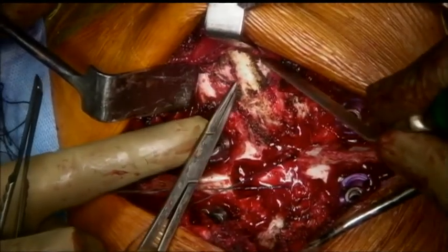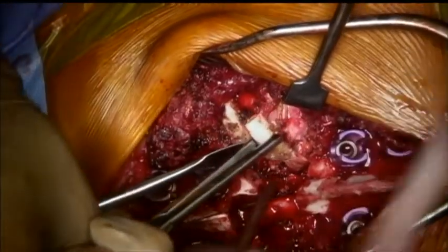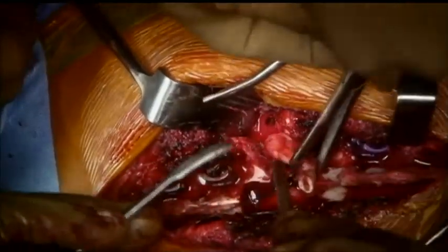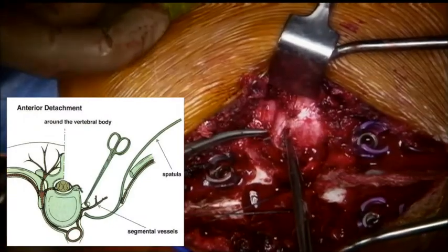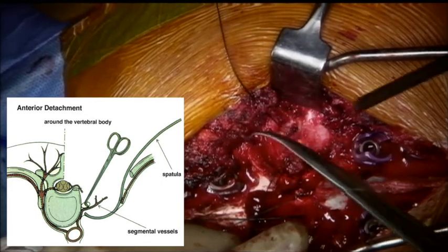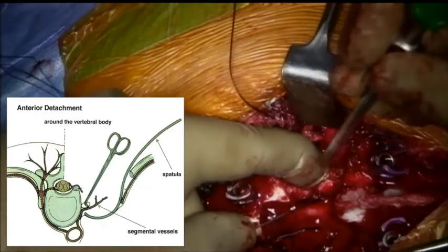The T5 and T6 ribs on the left side are being removed. The rib is cut about 3 to 4 cm laterally, dissected free of the pleura, and removed entirely along with the rib head. Similarly, the T6 rib is removed. The neurovascular bundle running beneath the T5 rib is isolated and divided. This allows for blunt dissection along the lateral wall of the vertebral body, taking care not to injure the segmental vessels at this stage.